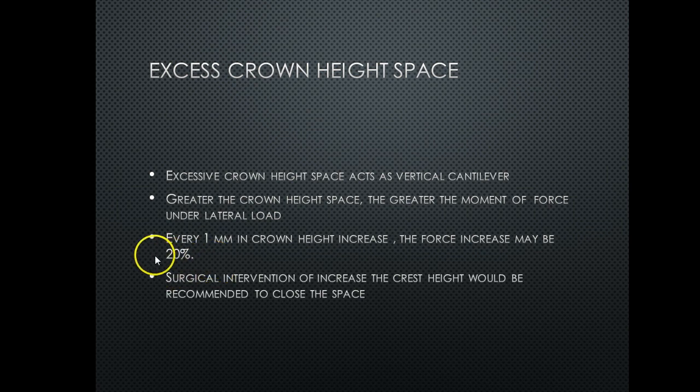So we have to be very cognizant of whatever we discussed before in the type of prosthetic we're using, and whatever the height length we suggested, to be in that ballpark and to try to overcome it. Making the crown longer will actually have a destructive effect on the implant itself and the prosthetic.